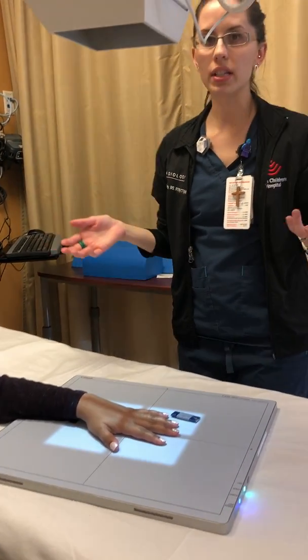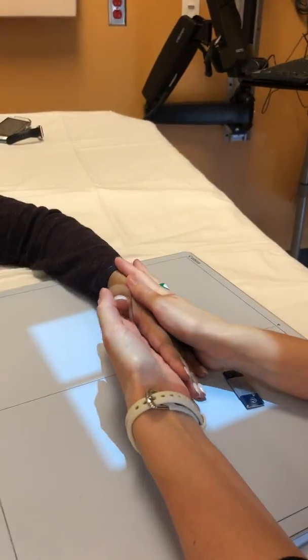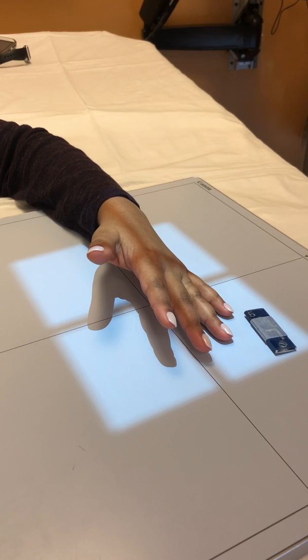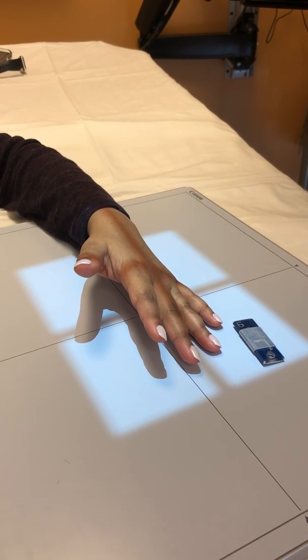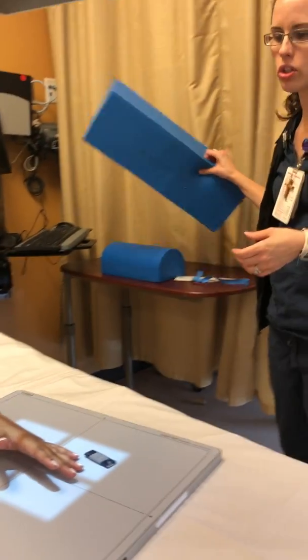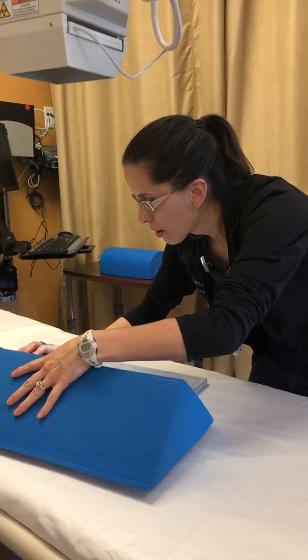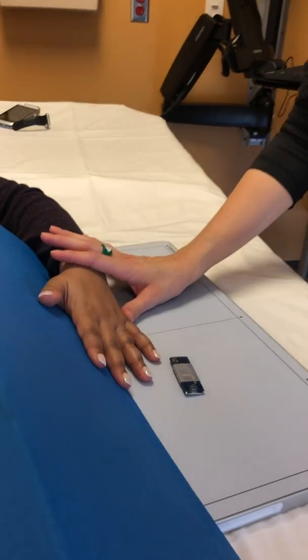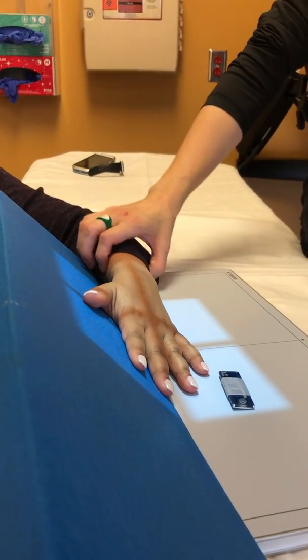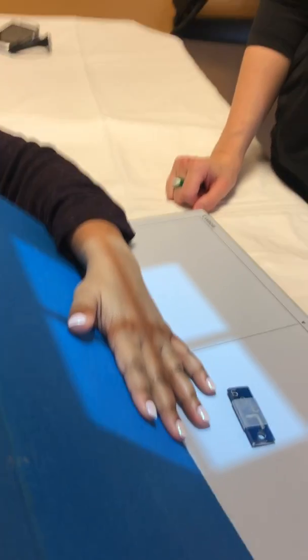Okay, now, very simple, we're going to do the oblique hand. A lot of times what I'll do is take their hand and just turn it at about 45 degrees. Central ray is going to remain the same. So I adjust it just a little bit, and there's your oblique. Another way you can do that, if you have positioning sponges and a patient that's unsteady, and I apologize, this is such a big sponge, is to place their hand on a positioning sponge to keep it nice and stable for you, making sure that you have a nice still x-ray. Of course, motion is the worst enemy of radiology.